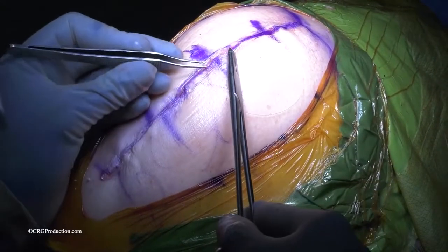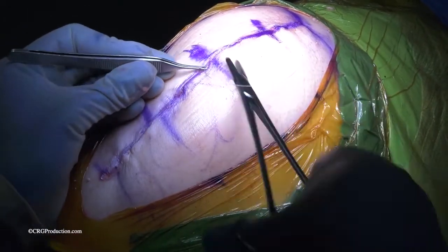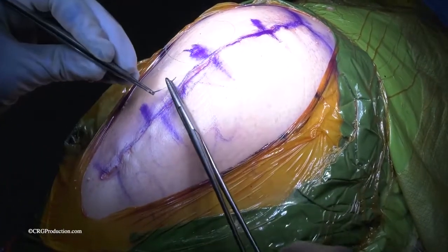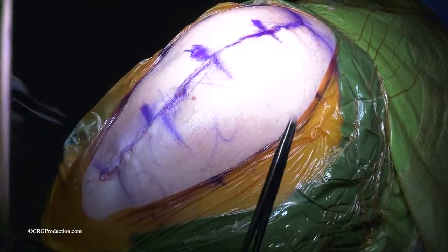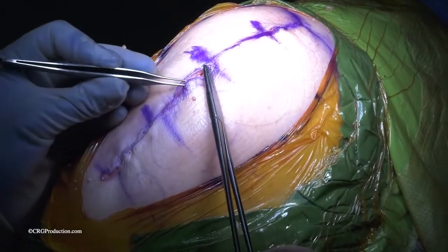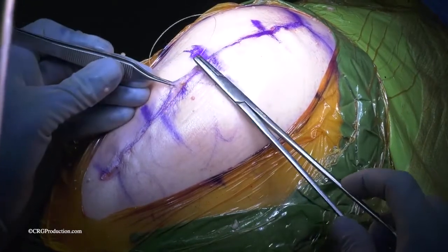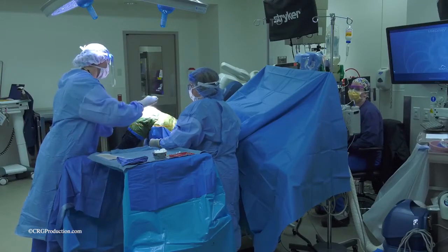Dr. Zabilski started doing it first, followed by Dr. Reitmeier, and then I was last. And it seems like there's no question that these surgeries provide excellent results. It appears that there's less damage to the surrounding tissues, and that's actually been discovered by a recent paper, noting that the patients appear to recover faster. We're not pushing around the tissues as much. We don't have to. The robotic arm doesn't require that you do a large exposure.